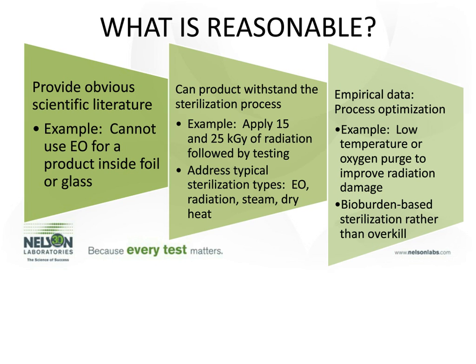And then, as I mentioned previously, look at a bioburden-based method rather than overkill. Radiation is always a bioburden-based method, but even within radiation there are other methods than the more traditional validation approaches that can be used to result in lower doses. The same would be expected if it appears, for example, that ethylene oxide is showing reasonable results; then the next expectation, if you need something shorter, would be to look at a bioburden-based approach.